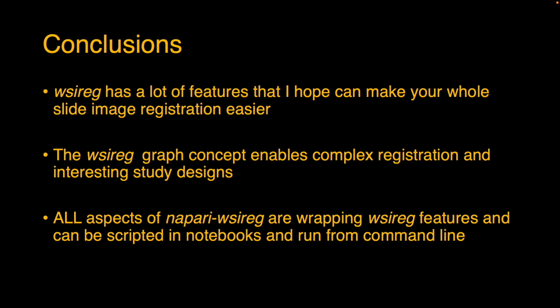Again, I just reiterate this point that all aspects of Napari wsireg that I've shown here are wrapping wsireg features. So the GUI can take some time to set things up, but if you become more proficient at this and you know which features you're going to need from wsireg, you can script them in notebooks or even run them from command line configurations. If you're curious about all of that, you can visit the wsireg GitHub and look at the documentation there. There are different examples of setting up alignments through just Python scripts as well as from command line configuration files.